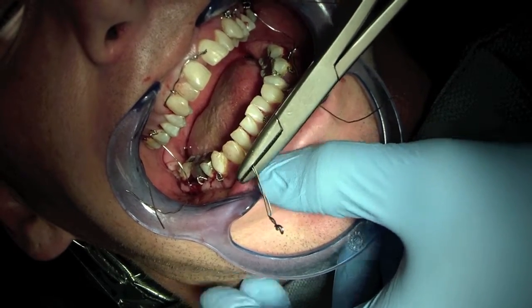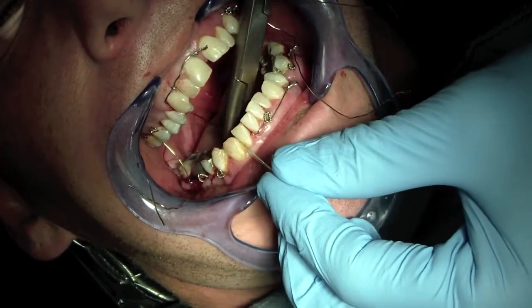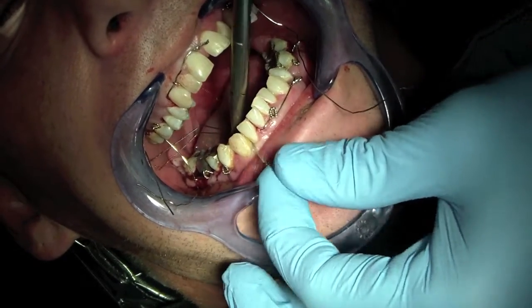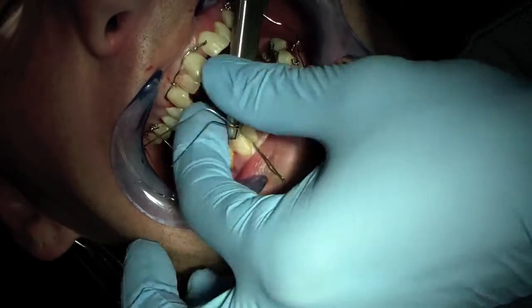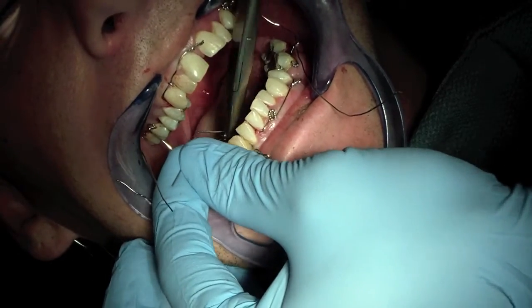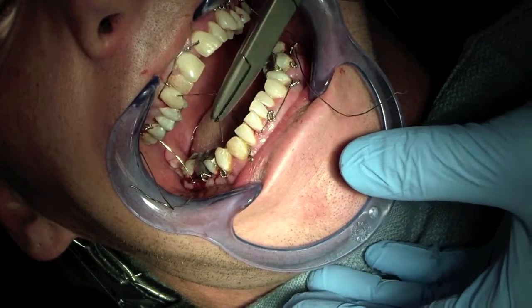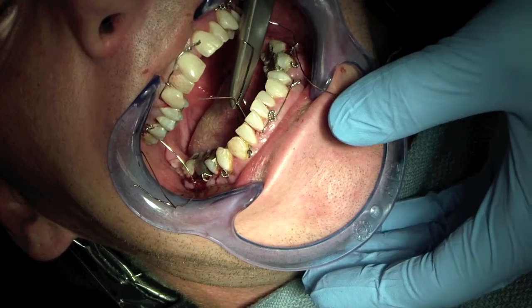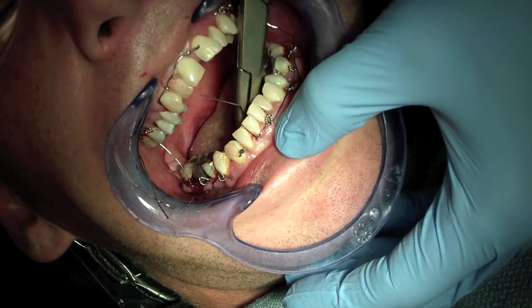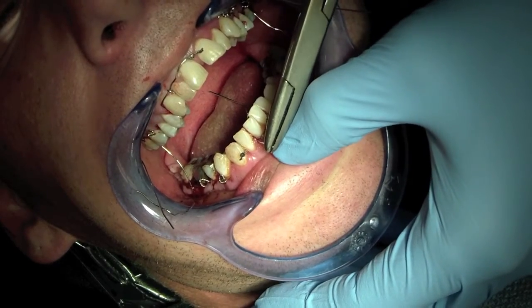So what we're doing here is we're finalizing the placement of the Ivy loops. Of all the footage I got, this is about the clearest that I had. You can see the rest of the Ivy loops placed in the posterior of his mouth. I'm pulling the Ivy loop through the interdental papilla below the contact, and now I'm going to bring one half through below the adjacent contact.